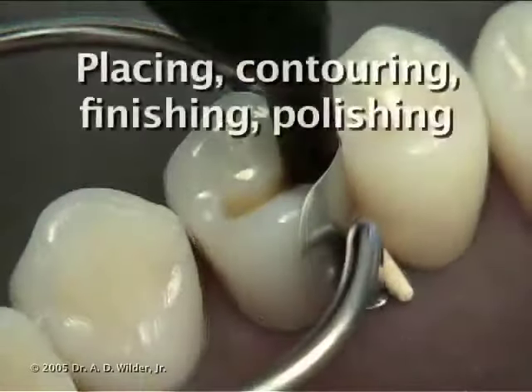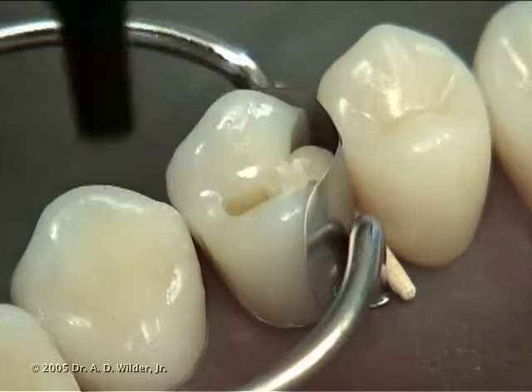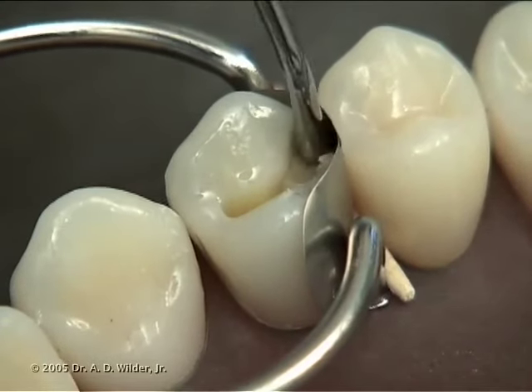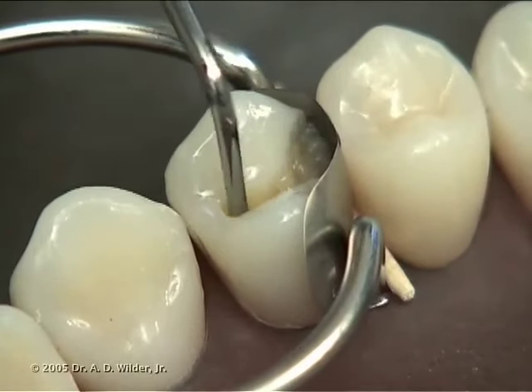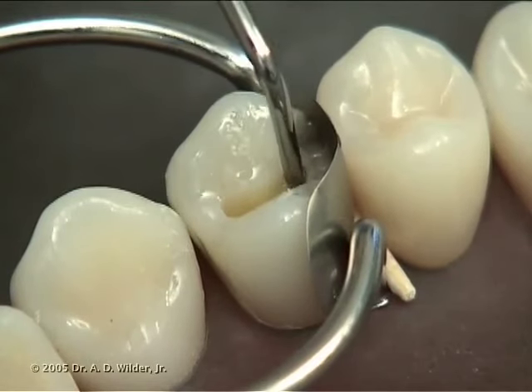Place your first 2x2 millimeter increment of composite material into the proximal box area, compacting it with a blunt hand instrument to ensure that no voids are present. You can dip the end of the instrument in a tiny bit of adhesive to prevent the composite from sticking to it during this step.